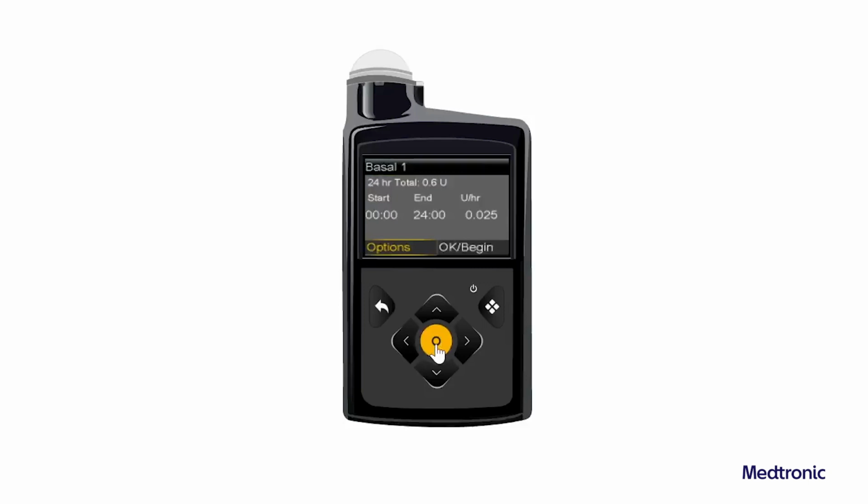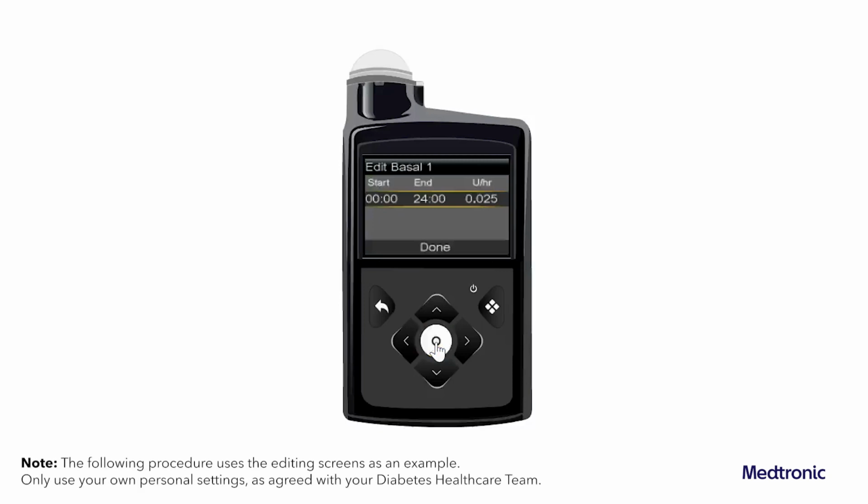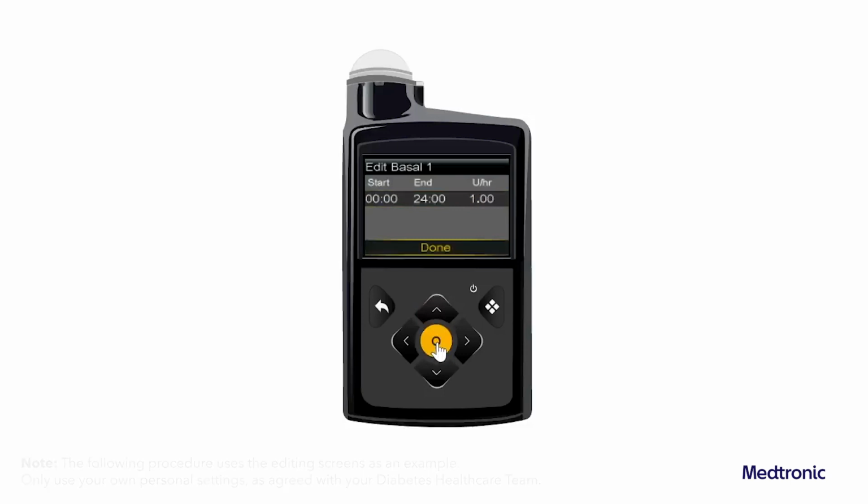Select Options and then select Edit. For one basal rate, the end time does not need to change. Press on the 2400. Select Done. Review the basal pattern. Select Save. Please note, if the back button is pressed and Done is not selected, the changes are not saved.